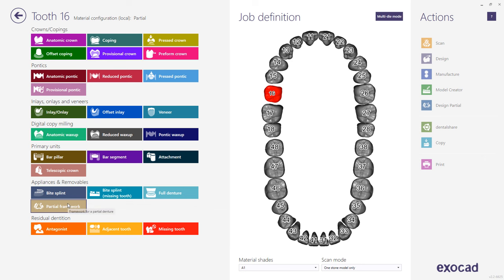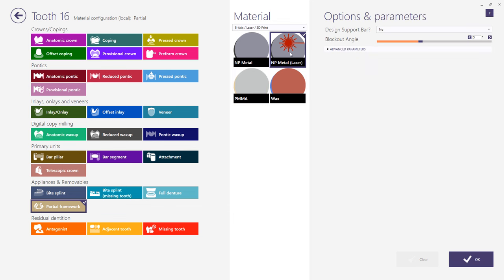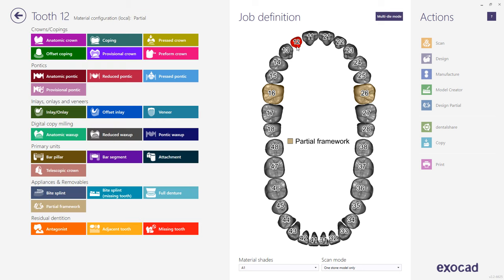For a visualization tooth, choose Partial Framework. There are four material options for partials, each with unique default settings. Use the hotkey Control to duplicate the properties to the next tooth with the same restoration type. Next, for a metal backing, choose Reduced Pontic.